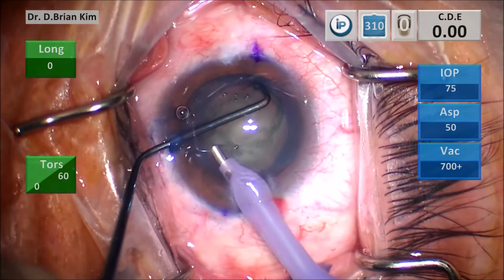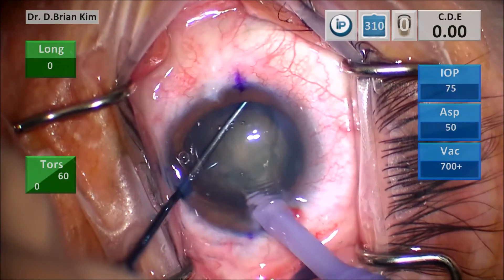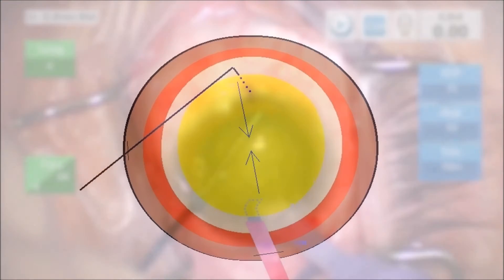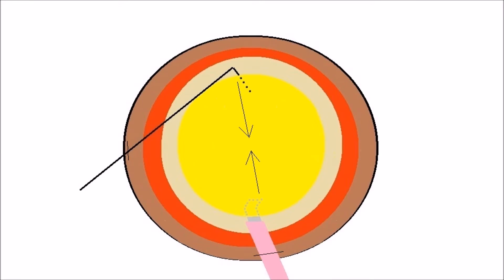And so you'll see after I move the epinuclear material on the surface of the lens, place a chopper out to the equator. The phaco tip is going on the surface of the lens, and I'm burying it into that lens material. As I bring both instruments to the center, I will then fracture the lens.